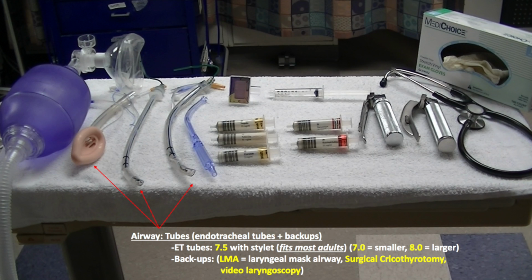Airway. What you see are 2 endotracheal tubes with stylet placed, in addition to a rescue airway on the left. Endotracheal tubes come in various sizes. The most commonly used size is 7.5. You can use a 7.0 endotracheal tube for smaller adults and an 8.0 endotracheal tube for larger adults.